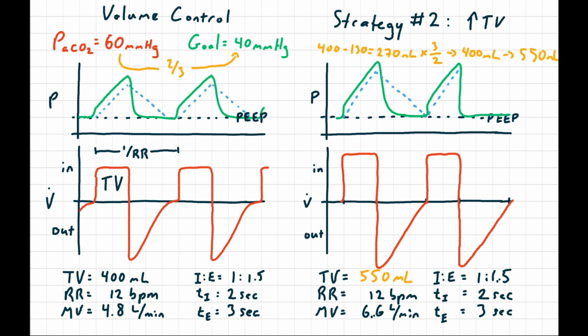So we've successfully increased our ventilation, which will decrease our alveolar and arterial carbon dioxide partial pressure. We've just barely squeaked by without causing auto-PEEP, and the real big side effect that we caused here is that we increased the plateau pressure, the highest value that the pulmonary pressure reaches. So this is complication or trade-off number 2 for today. We've increased our plateau pressure.